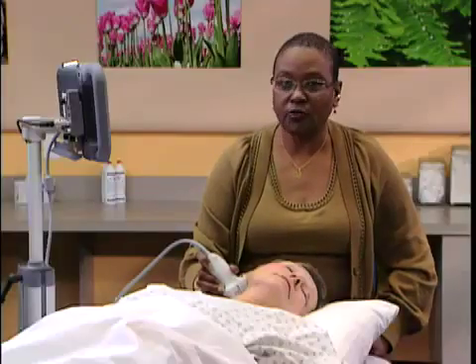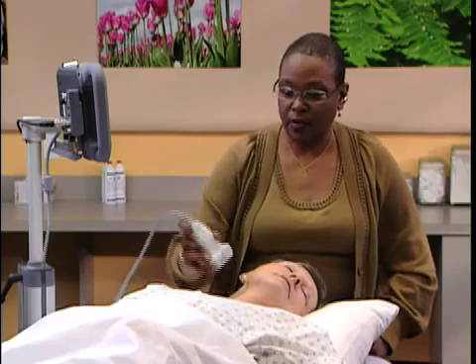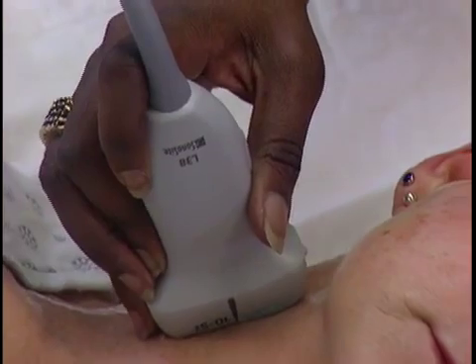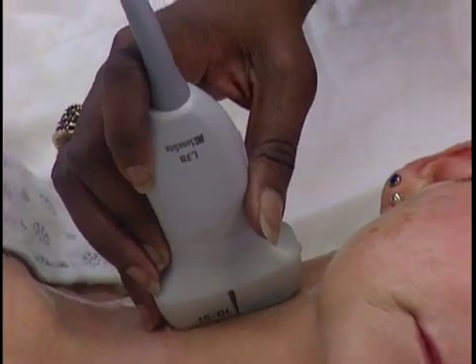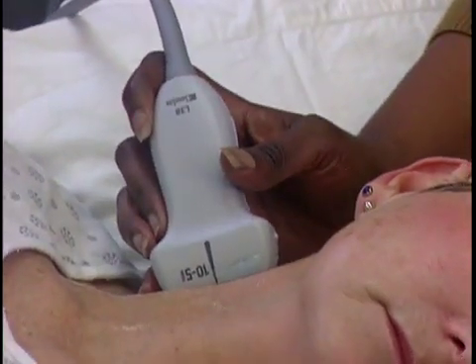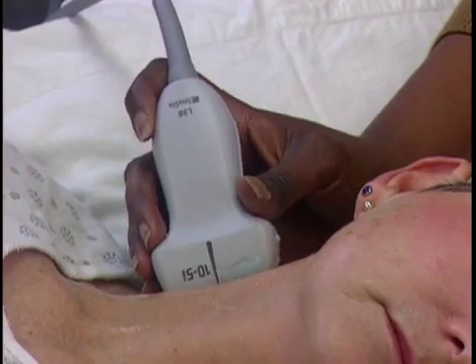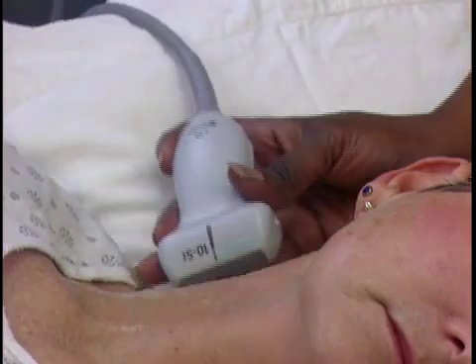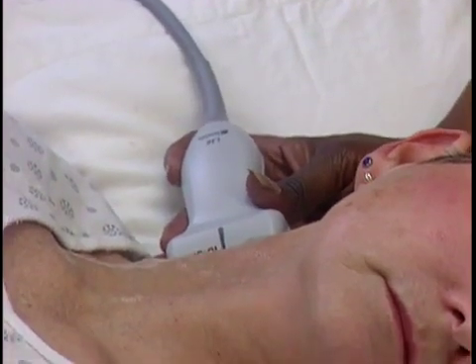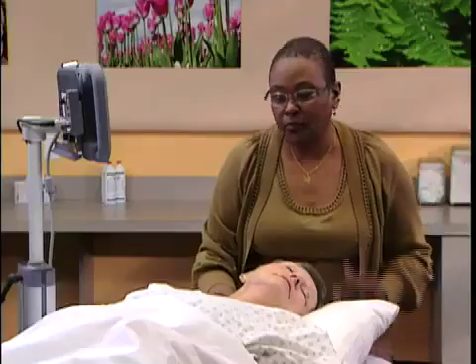You want to scan the patient from three different angles: from the anterior aspect of the neck, roughly 2 o'clock; then from the lateral aspect of the neck, that's about 4 o'clock; and then from a posterior aspect of the neck, which is about 5 o'clock. Three angles — anterior, lateral, and posterior.